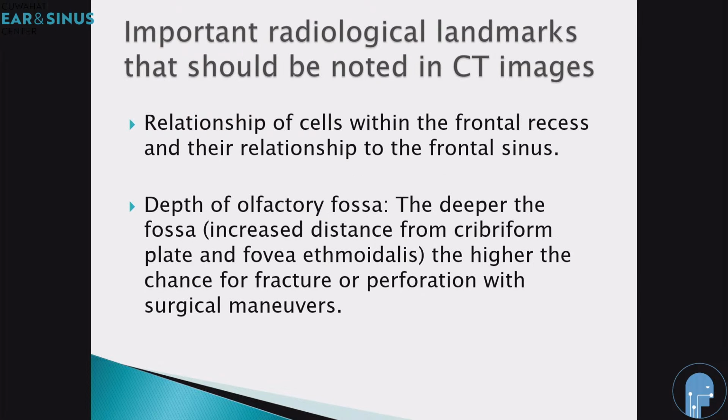What are the important radiological landmarks that should be noted in a CT scan? Relationship of the cells within the frontal recess and their relationship to the frontal sinus.